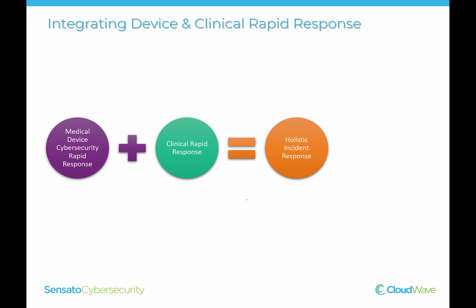holistic incident response. So what does holistic incident response look like? Well, an incident is reported to one of those three inputs, whether it's through the SOC, to your clinical engineering team, or to your help desk, right? And regardless of where that report comes in, all of those three entities know how to triage that situation. And each one of those entities, once they've triaged it, can put things in motion, right?